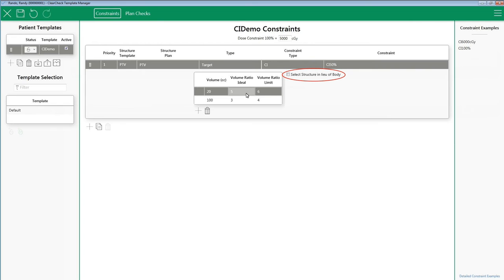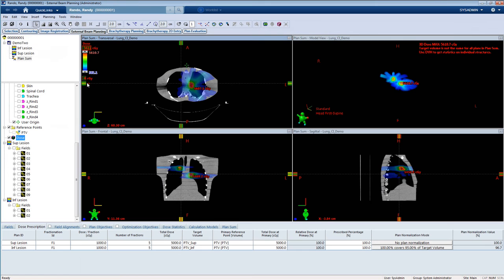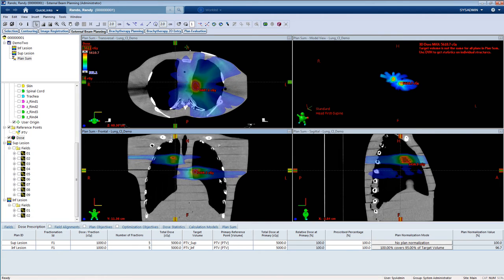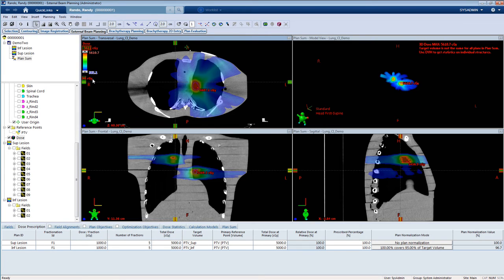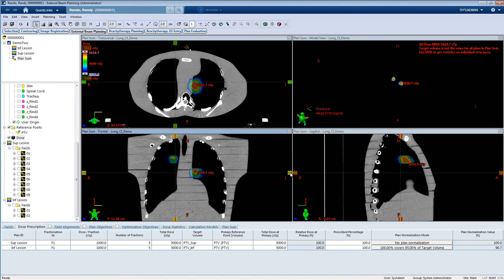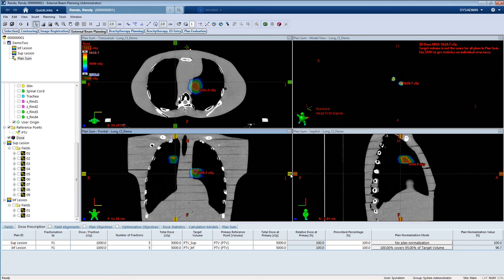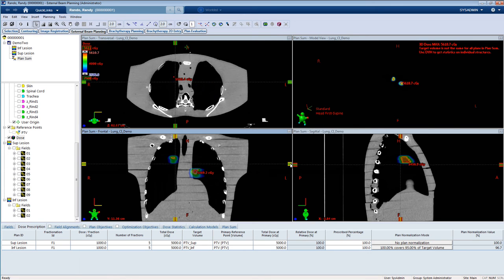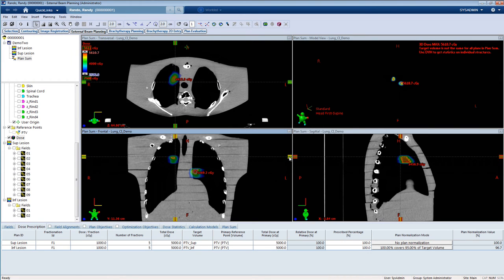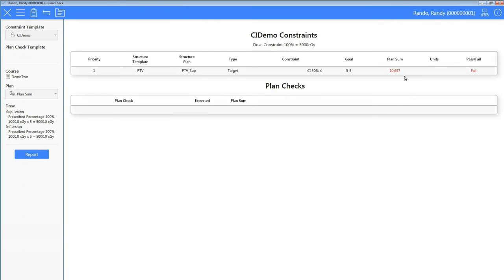So, in this example, I have two lung lesions with plans already done. I want to run a conformity index on PTV sup and I want to do it on the 50% isodose line, or in this case, 2500 centiGray. But I don't want this isodose down here from PTV inf to be added into it. If I leave this setting as the default in ClearCheck, you can see on the plan sum that it reports a CI of 10.697.